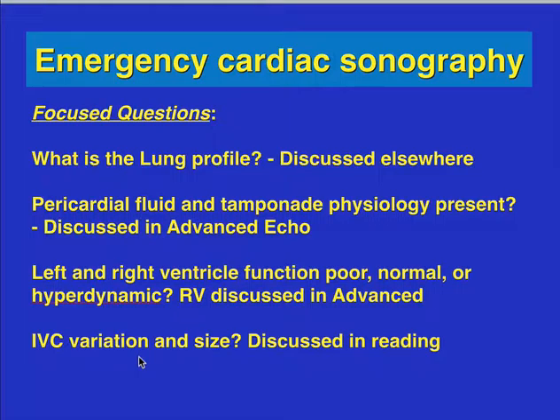The left ventricle and right ventricle are discussed in a little bit more detail during the respective lectures. And then IVC variation and size. That's again discussed in reading and a short lecture to follow in another module. But these are the focus questions that you should ask yourself every time you do an emergent cardiac sonography.